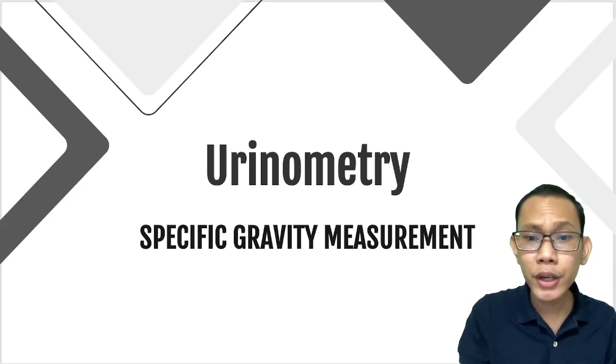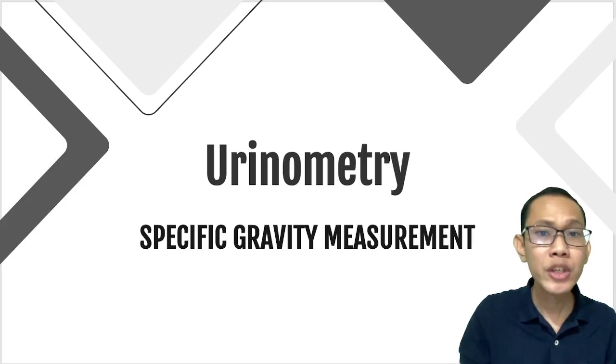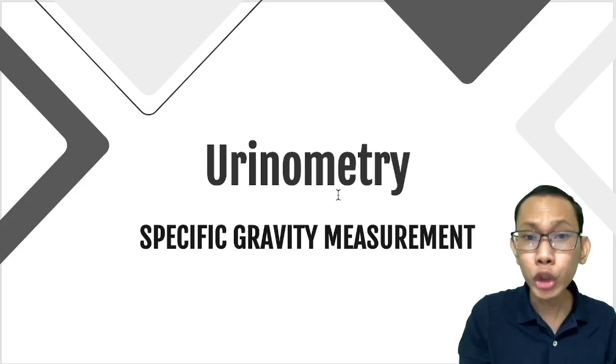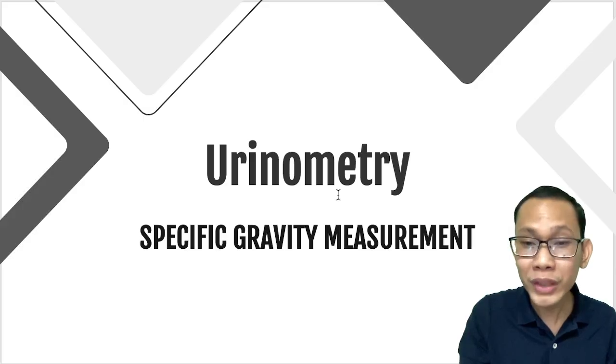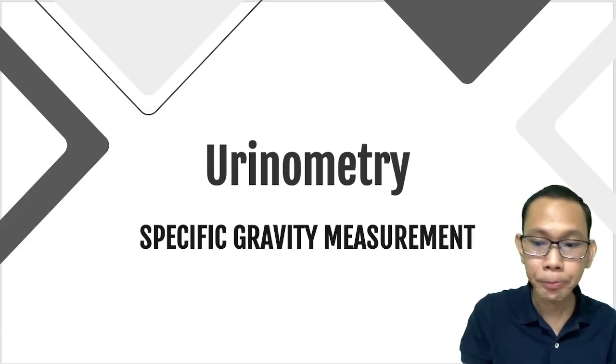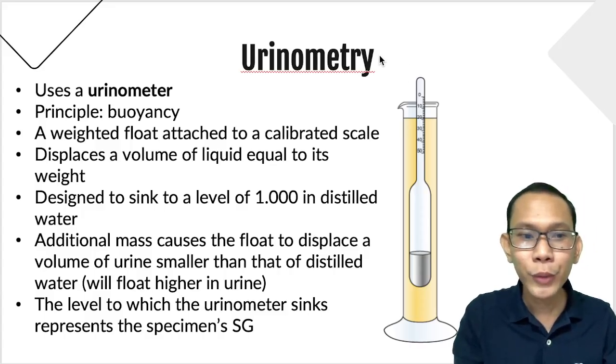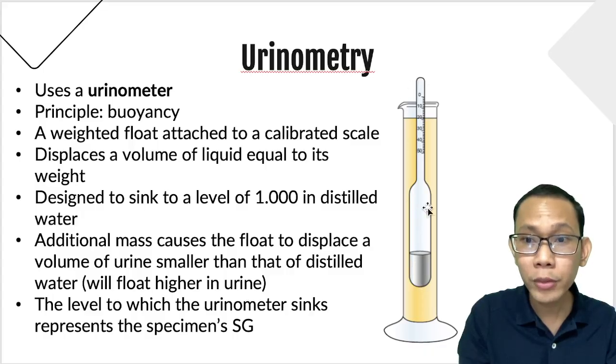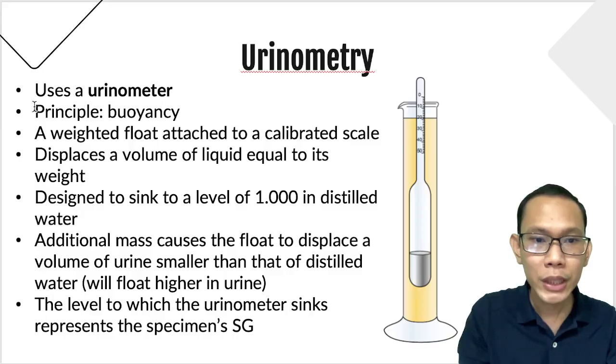Let's discuss first your urinometry. Do not worry, I will be sharing different video demos of these methods, so that at least we can visualize how you will do the methodology of urinometry. I will be providing YouTube video demos of your different methodologies. So again, we have urinometry. It uses a device which is your urinometer. This is our urinometer. The principle is based on buoyancy or density.